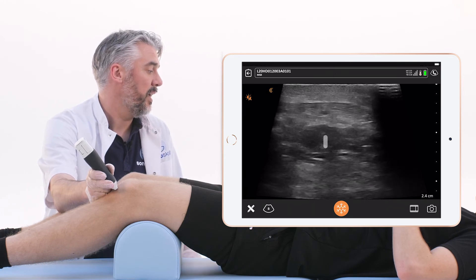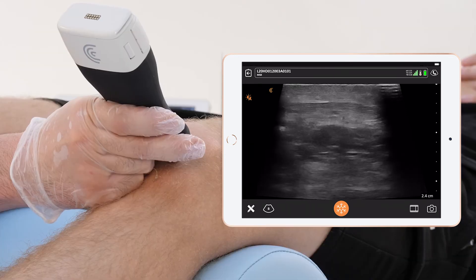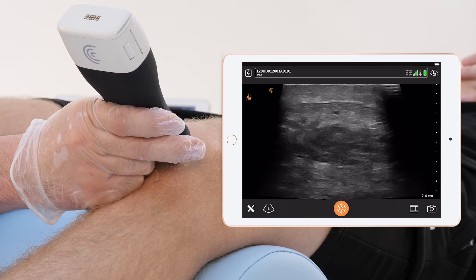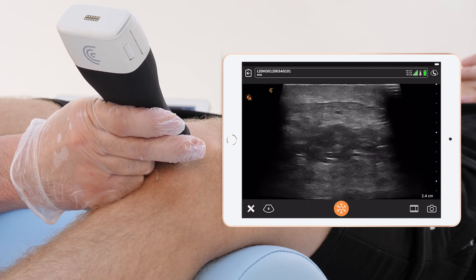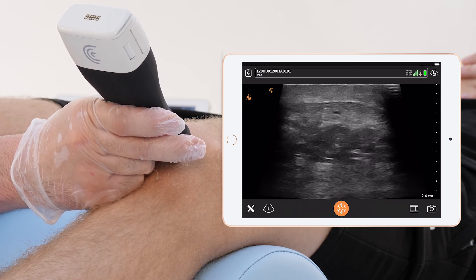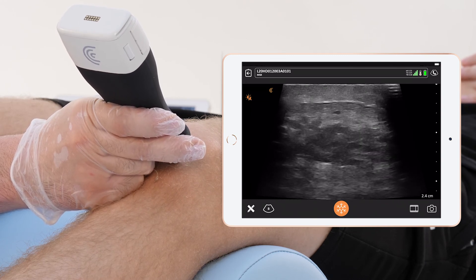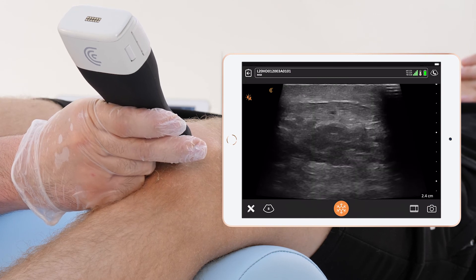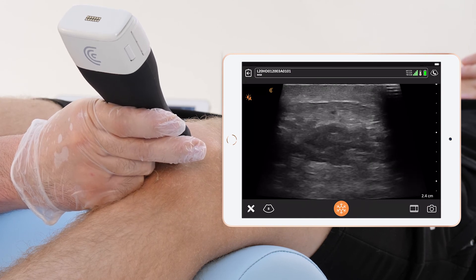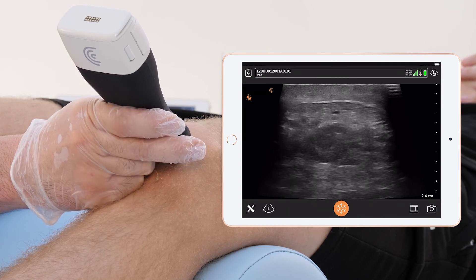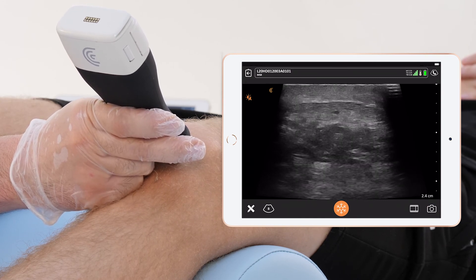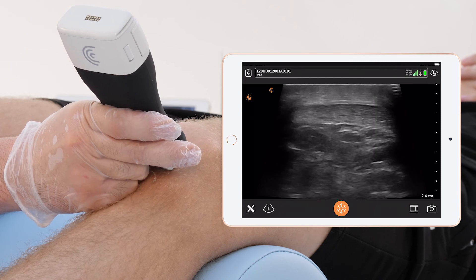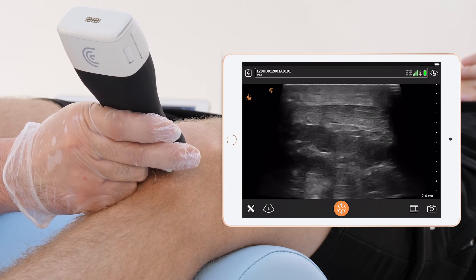We can see that the partial tear is actually very small. It's in the middle of the tendon — not very wide. It's long but not very wide; it's like a pinhole in the tendon. We can then follow the tendon distally.